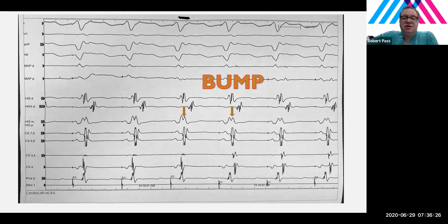But using CARTO or ESI, you can actually find the exact point, because it's recording all of the signals continuously, as well as recording where the ablation catheter was at the exact moment that anything occurred in the case. So we were able on CARTO to identify this signal going to this signal, and we could see exactly where the ablation catheter was. And in fact, it was immediately next to where Dr. Love had the catheter. So he really had not moved virtually at all.